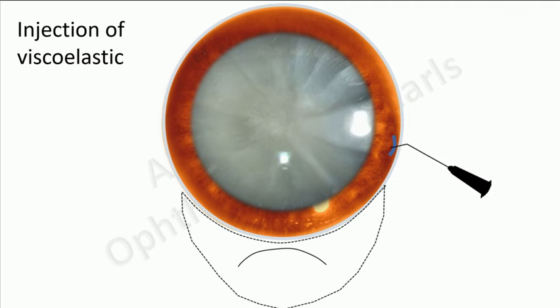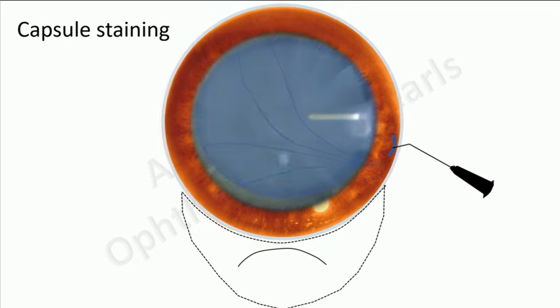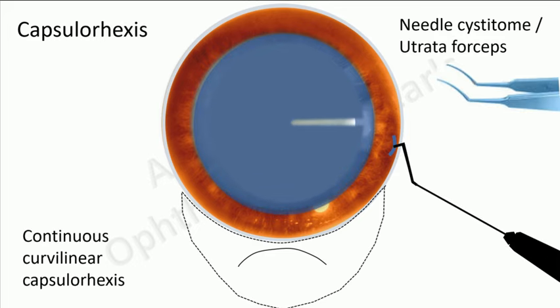Viscoelastic is then injected to maintain the anterior chamber and to protect the corneal endothelium. Capsule staining is optional. Trypan blue is injected into the anterior chamber and washed out after about 30 seconds. This stains the anterior capsule, making it more easily visible. This is especially useful in a white cataract.